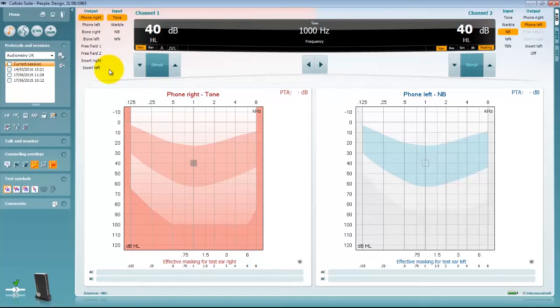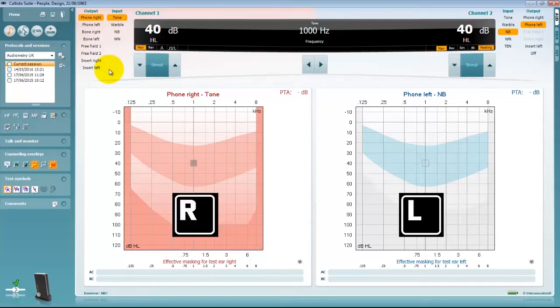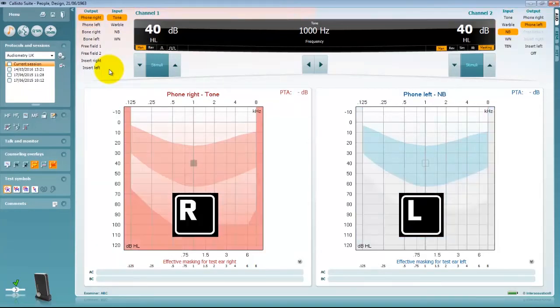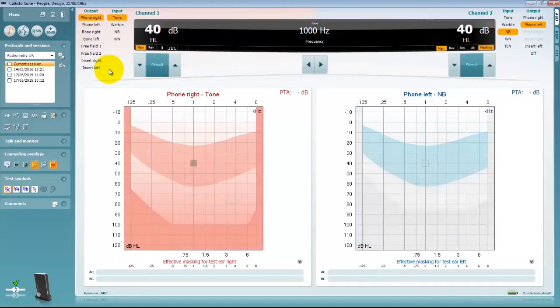The test ear can be swapped by pressing the L or R key on your PC keyboard. These shortcut keys resemble left and right.